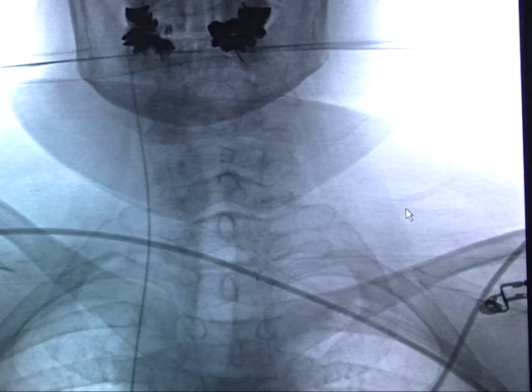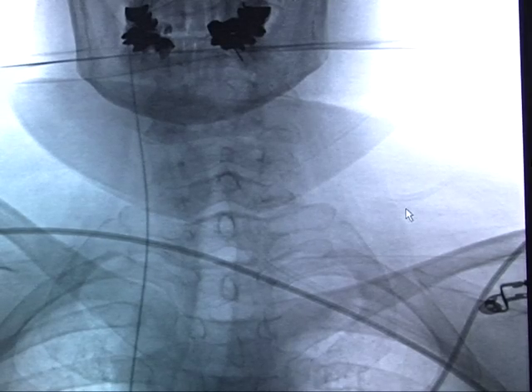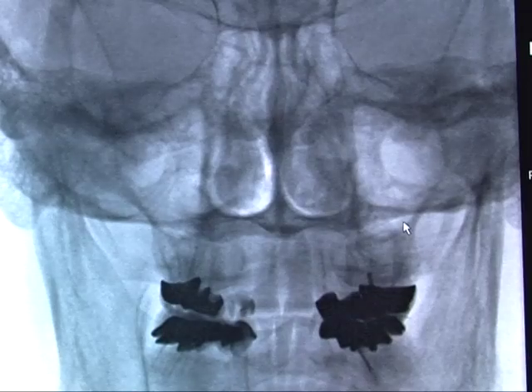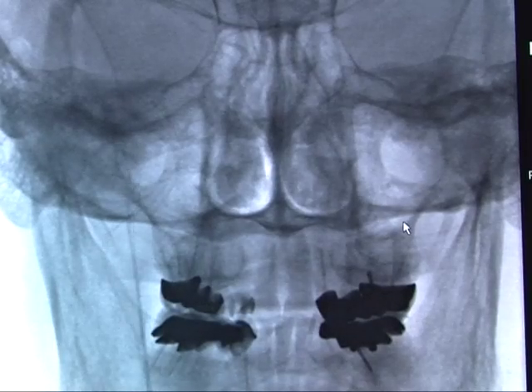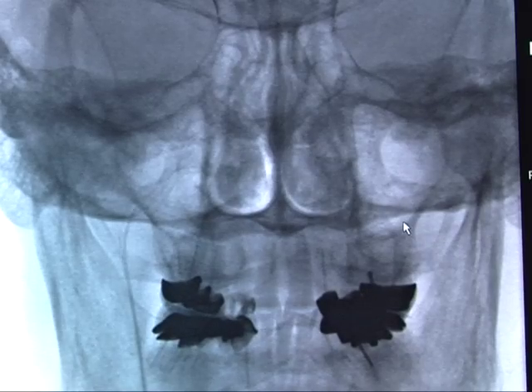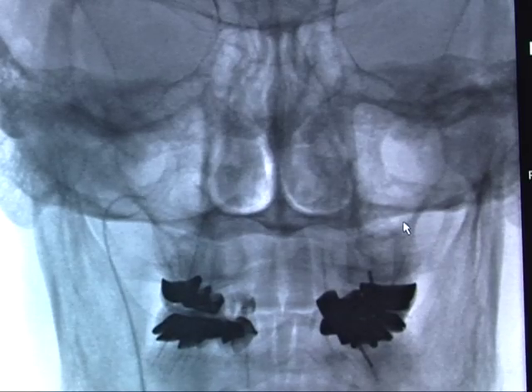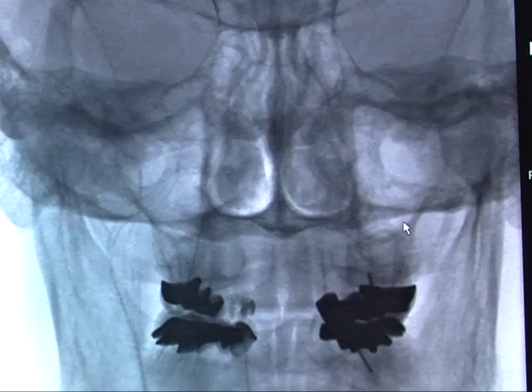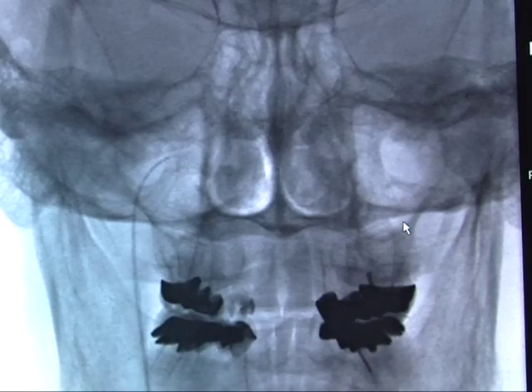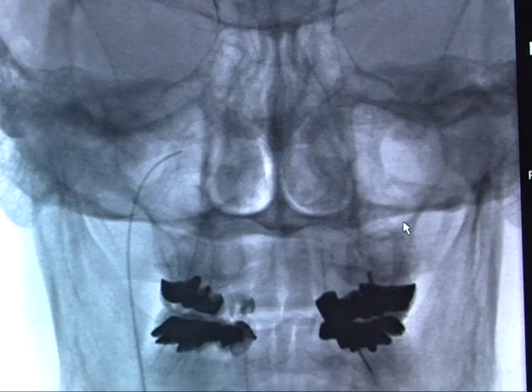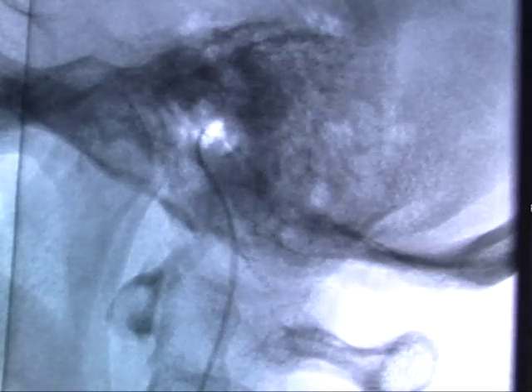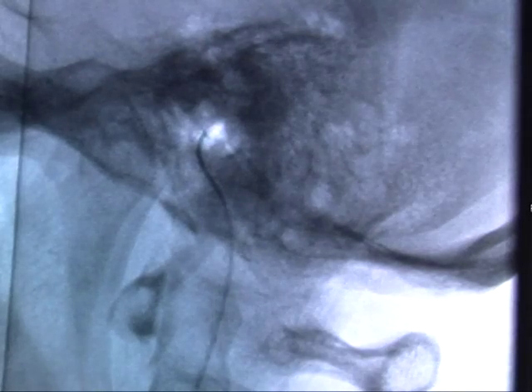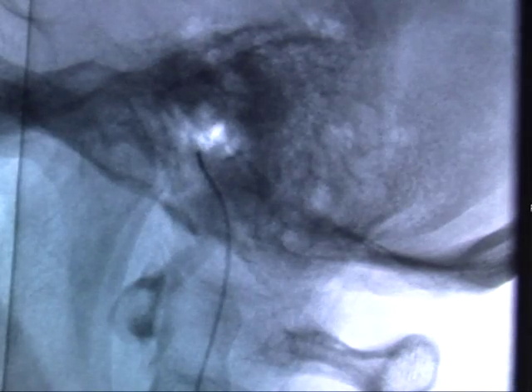We use a five French straight catheter for the right sided catheterization. The wire is being advanced, aimed medially and anteriorly using biplane angiography into the right inferior petrosal sinus. Here it is seen entering the right inferior petrosal sinus, also visible in a lateral view.